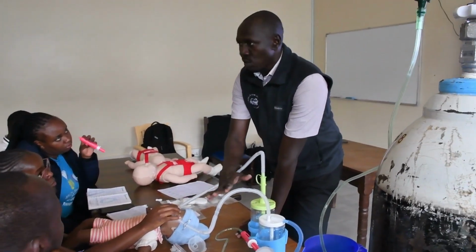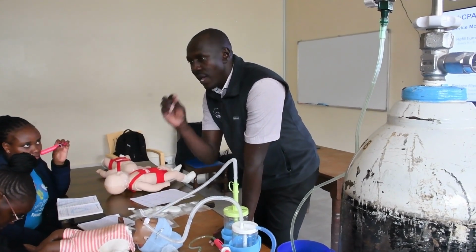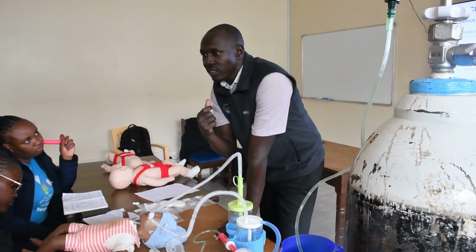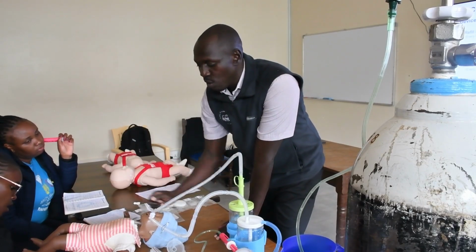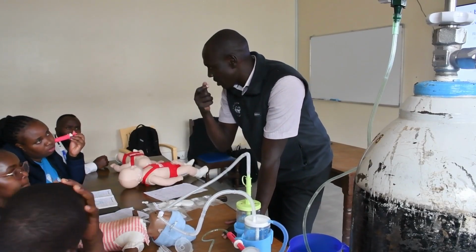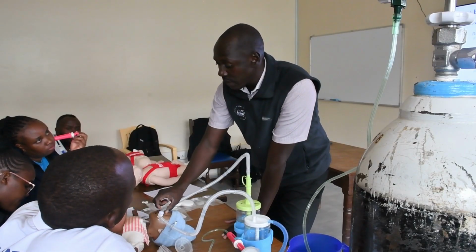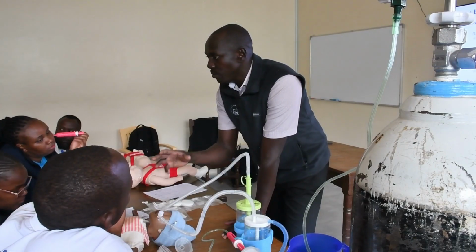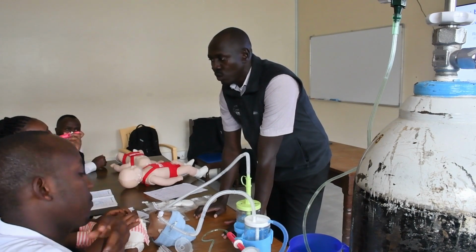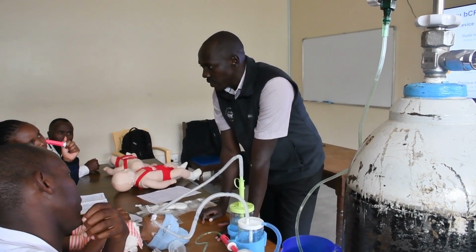So this is a closed system. If it is a closed system, you don't need an NG tube going into the nares again. It will create a leak. So make sure you put an OGT. If you put an NGT, the nares will be widened. If the nares are widened, then you will create a leak. It means the bubbling will not be the type of bubbling we want with these babies. So put the OGT for feeding.